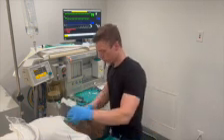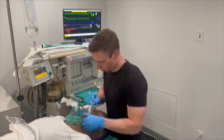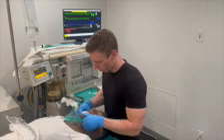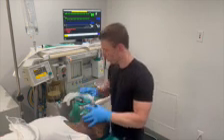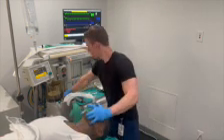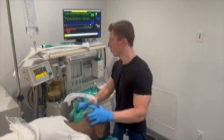You can always use an oropharyngeal airway to help facilitate your ventilatory efforts. While ventilating, we are assessing for adequate chest rise, misting in the face mask, an adequate end tidal CO2 waveform, and adequate tidal volumes. All are indicators of the ability to ventilate.